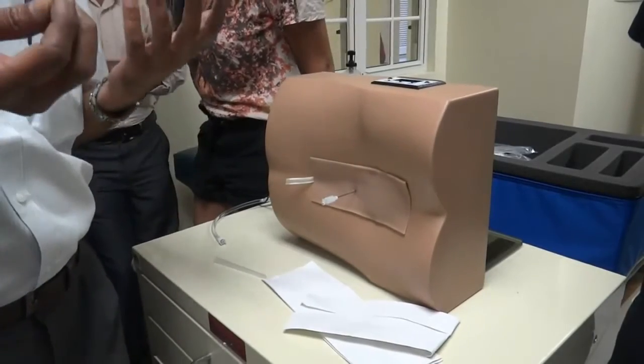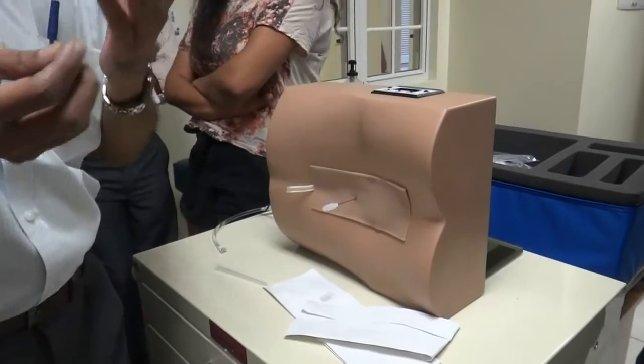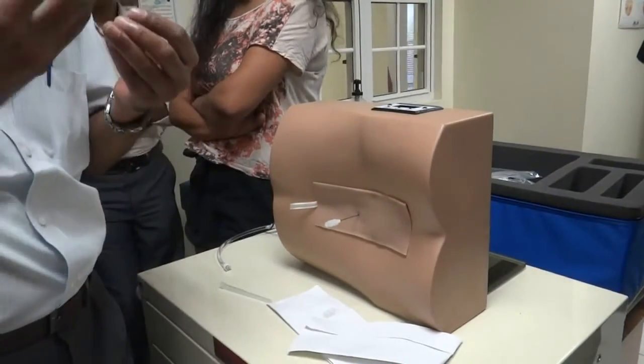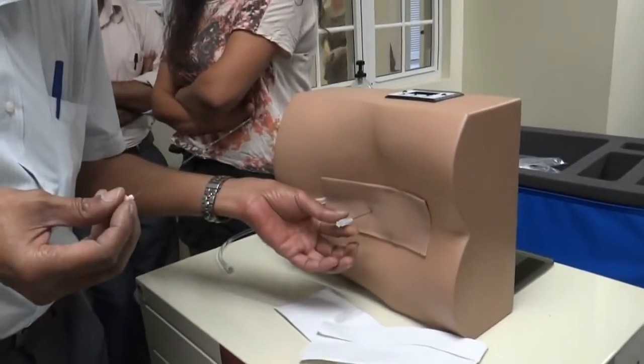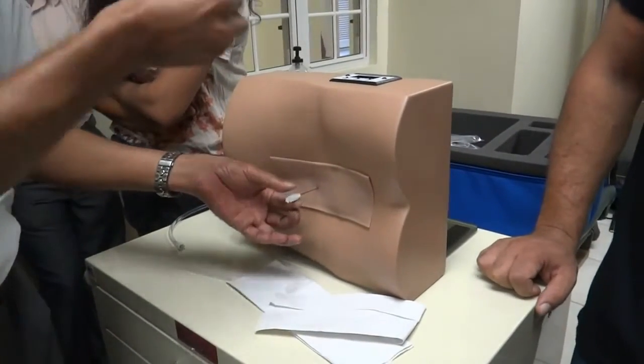In case in an actual situation CSF does not come out, there are three or four things you can do. One, you can ask the patient to cough gently. When you cough, the intraspinal pressure increases, then CSF starts coming out. If that doesn't work, you can gently rotate it in the longitudinal axis without going in or out.